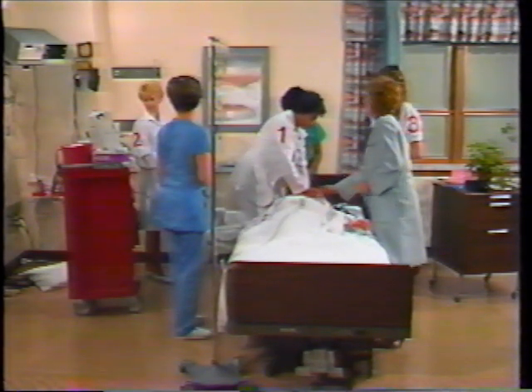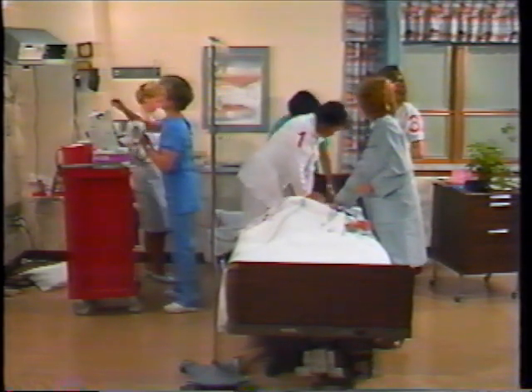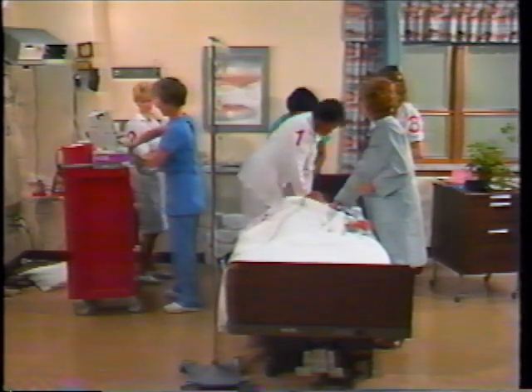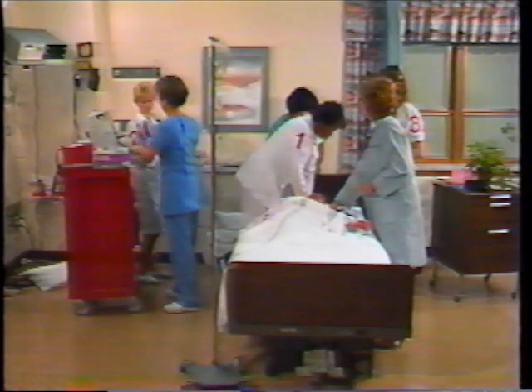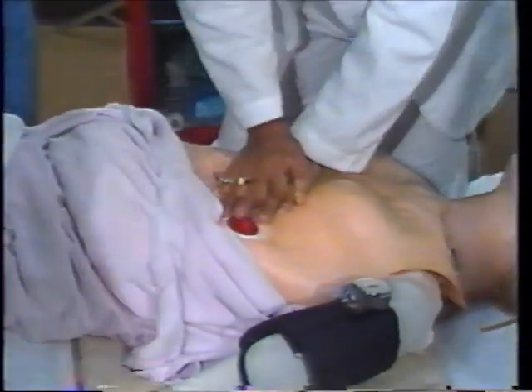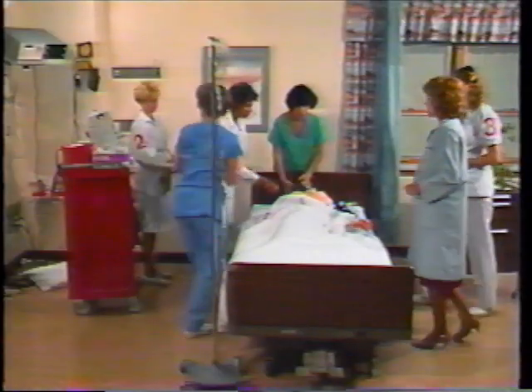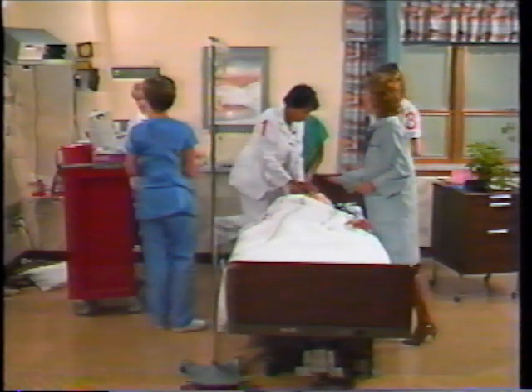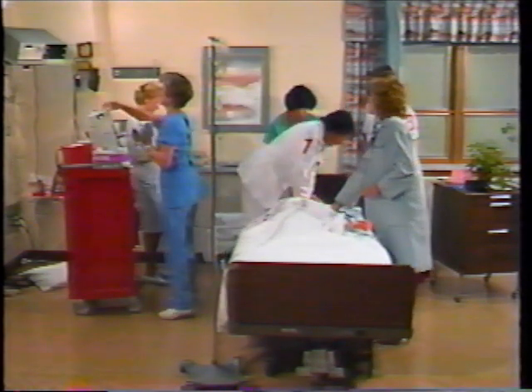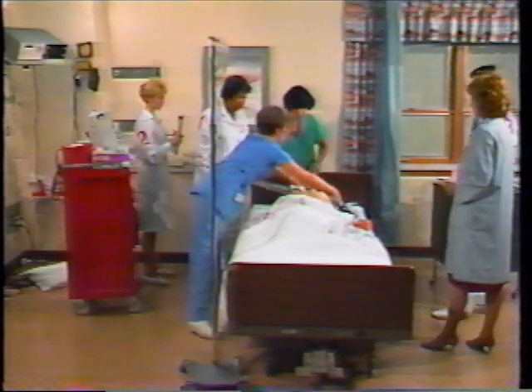Electrical activity. The physician sees some electrical activity on the monitor and orders defibrillation at 200 watt seconds. After preparing the equipment, the ICU nurse will apply the paddles to the chest wall, warn stand clear, and discharge the current. Clear. She's in VFib. The resulting rhythm is ventricular fibrillation. Defibrillation is again ordered, this time at 300 watt seconds.